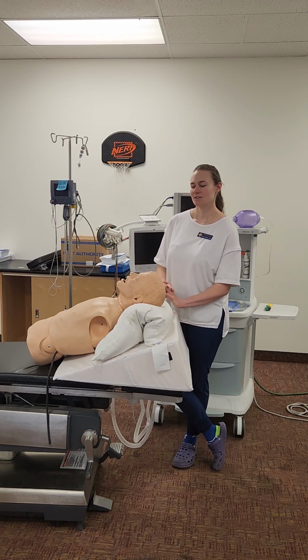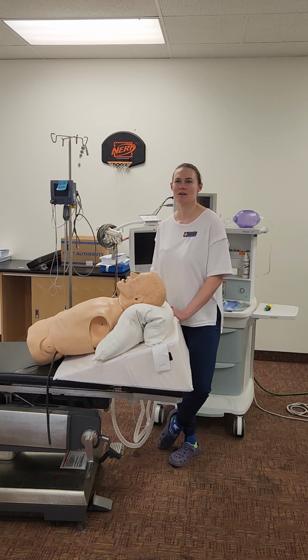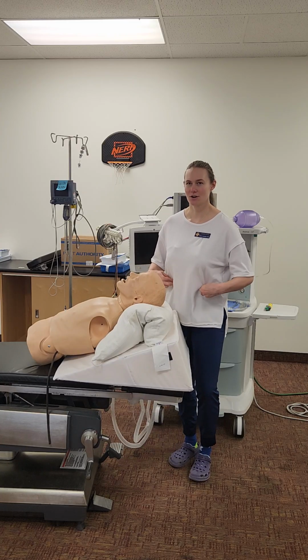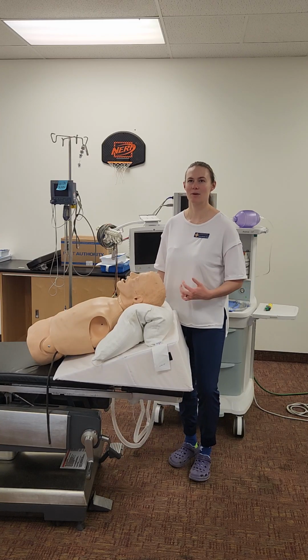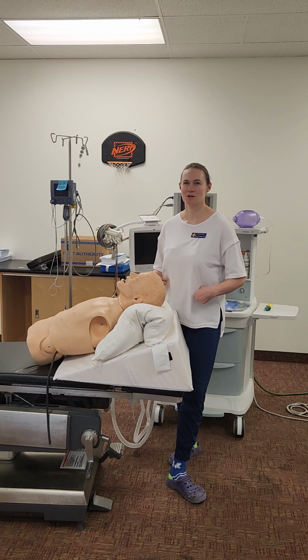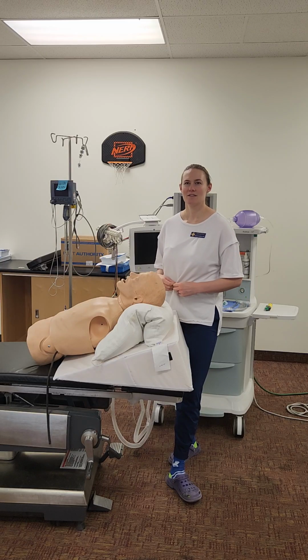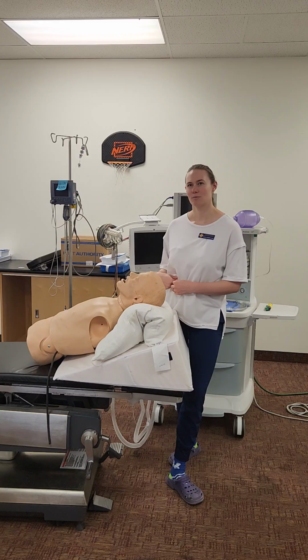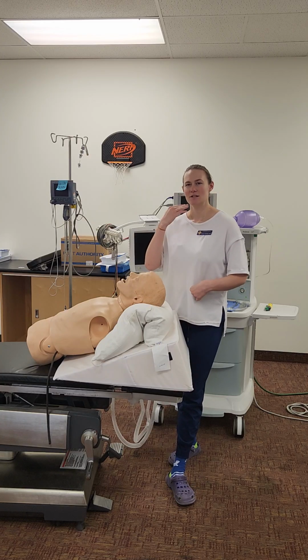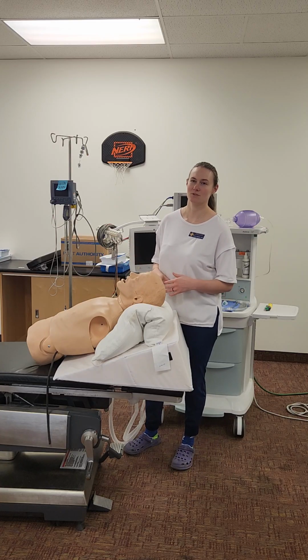So after I've done my thorough pre-op evaluation, I can talk about the procedure, risks and benefits with him. So this procedure is minimally invasive. We're just going to be using some trocars to do the surgery instead of opening you up with a big incision. We just have some small pokes that go through your stomach, and it grants us access to the organs that we need. There's a camera that lets us see inside, and we're just going to remove your gallbladder with those little instruments poked through your skin. And then we're going to put an ET tube down through your throat to help you breathe, because we will need to paralyze you to have the best outcomes for the surgeon.